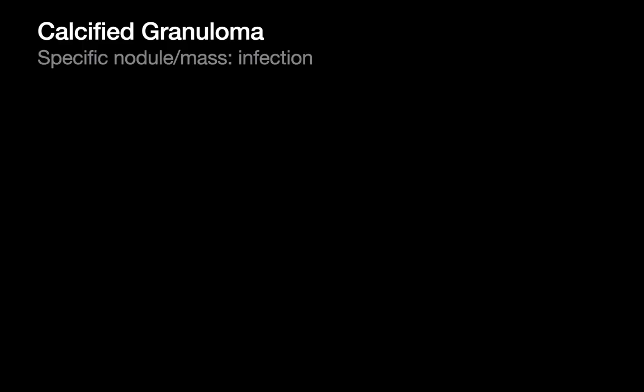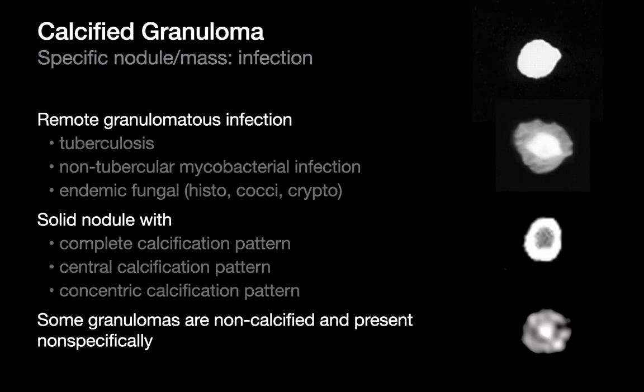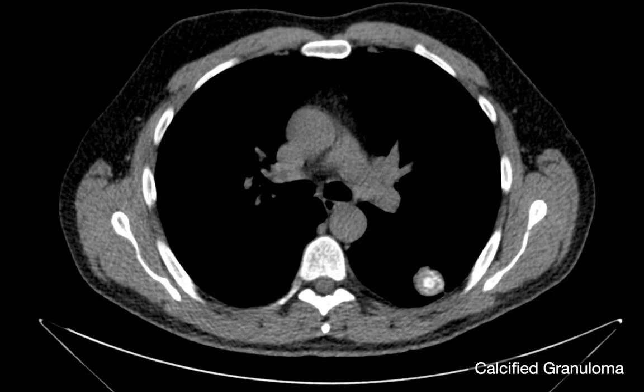The final entity on our infectious list is calcified granulomas — pretty common. Calcified granulomas that are uniformly calcified throughout, centrally calcified, or have a targetoid calcification pattern — these are all benign calcification patterns that are highly specific for a granuloma. So if I see a nodule that looks like this, we can be quite confident we're dealing with a granuloma and not have to worry about working it up as a nonspecific nodule.